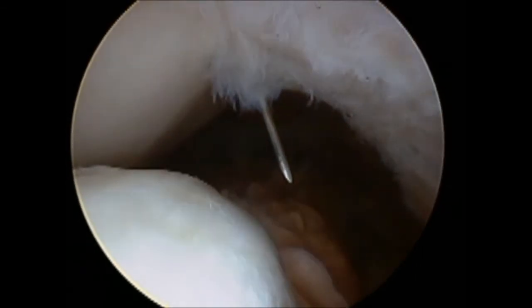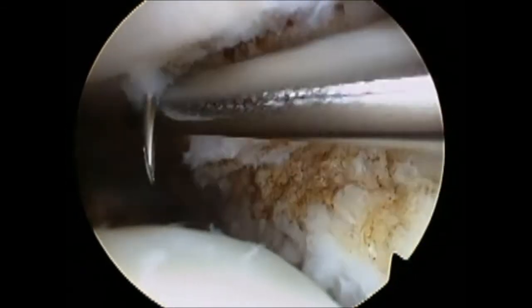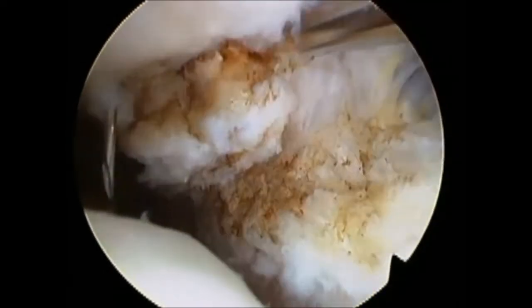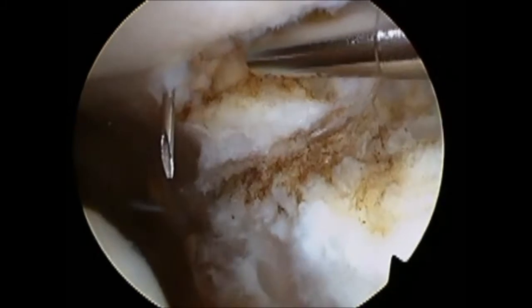The aim of needle localisation is to clearly demarcate the lateral border of the patella and avoid iatrogenic injury to it whilst removing the bipartite or tripartite fragment.